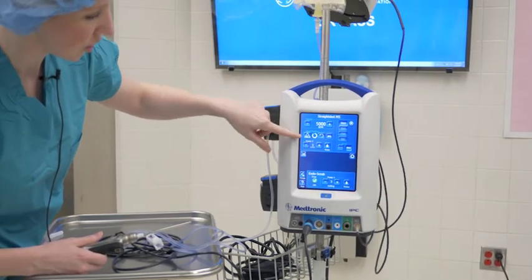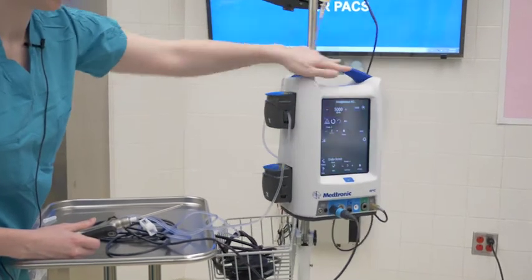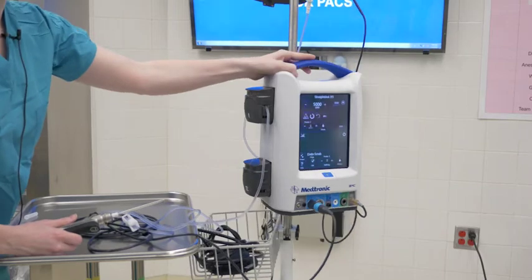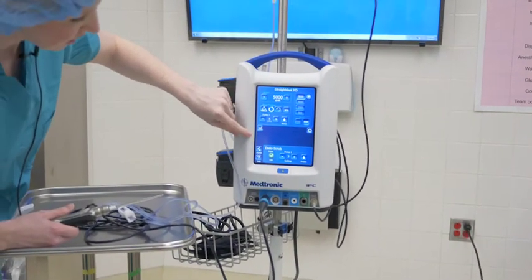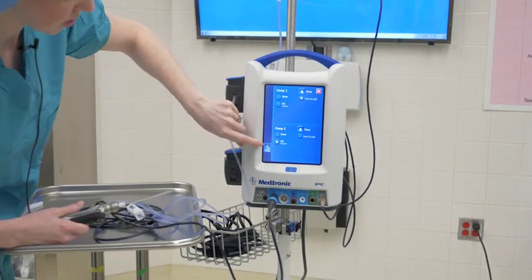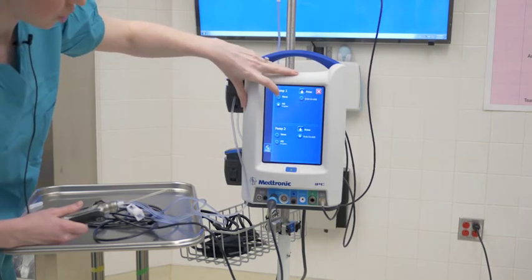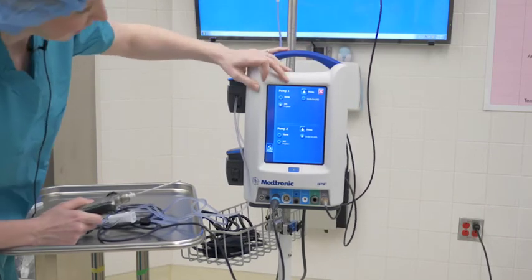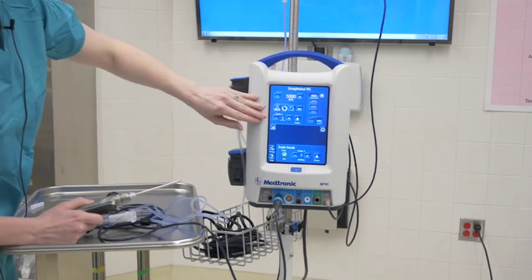So I want to show you that this says we're in pump 2 right here, but I have threaded the tubing through pump 1. This is a common thing that people will stumble upon, and all you need to do, you do not need to rethread, you just need to tell it which pump you've threaded the tubing through by going to pumps and saying pump 1 is your M5 irrigation. That is another name for this tool. And then you go back to the main screen by hitting pumps again. And now it knows you're in pump 1.